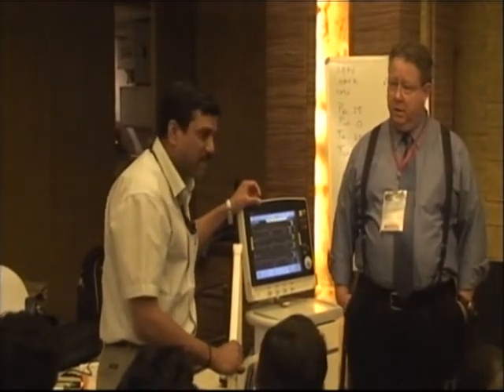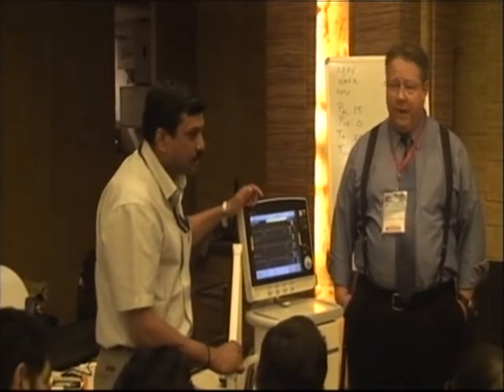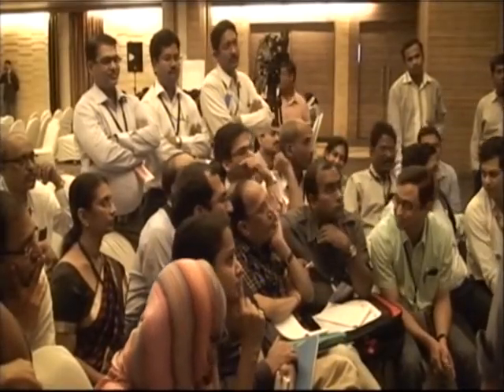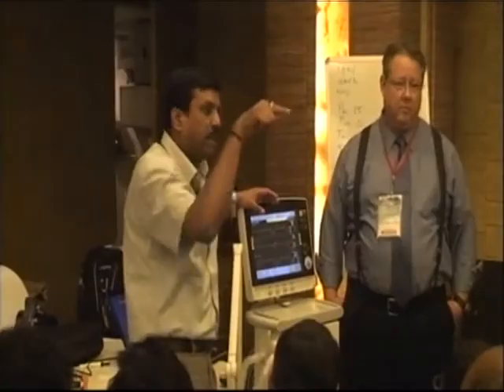So that is non-invasive. This is invasive. Right, no, this is on the ventilator. Yeah, and on BiPAP to maintain that peak, I would challenge you. Sir, if you are using pressure control ventilation with inverse ratio ventilation, the patient triggers, it goes back to the baseline and starts a new ventilation. So de-recruitment is happening.